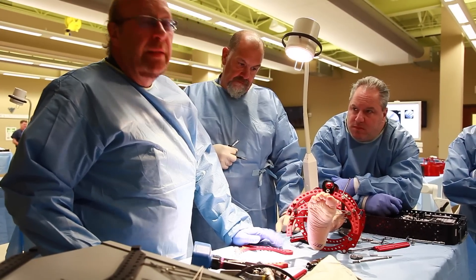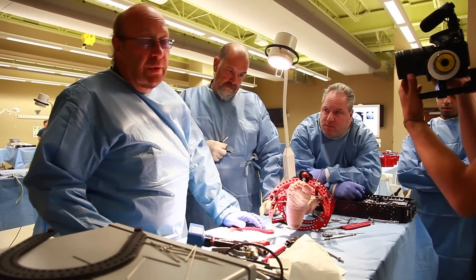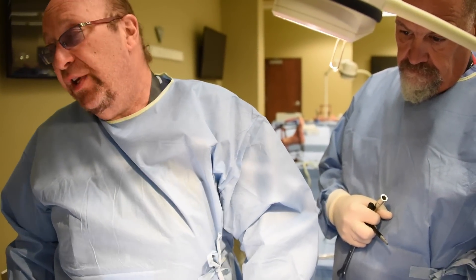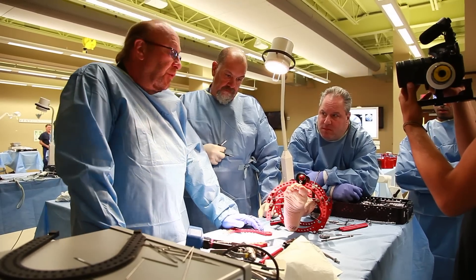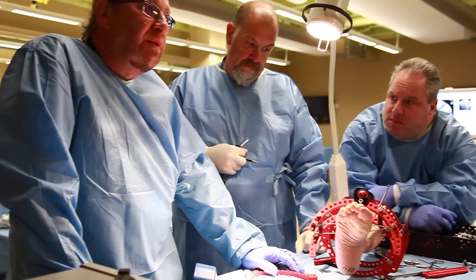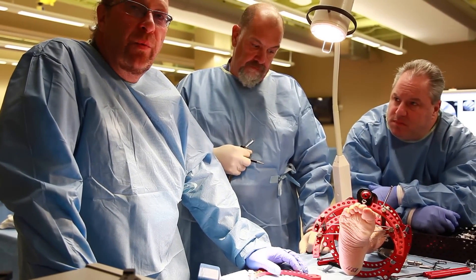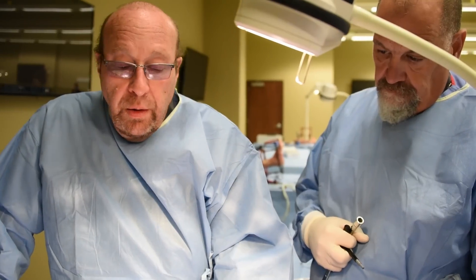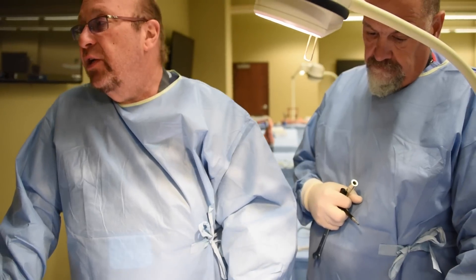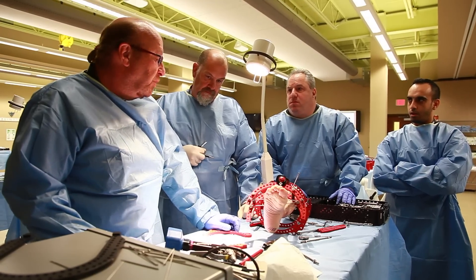We don't know exactly how many patients will progress to fusion of the subtalar joint — some studies say it's upwards of 80%. The beauty of doing it with external fixation is that even if they do require a subtalar fusion at some point in their life, we don't have to go in and remove the hardware. Therefore the subtalar fusion becomes a primary procedure instead of a secondary procedure with hardware removal, which maintains our soft tissue envelope.